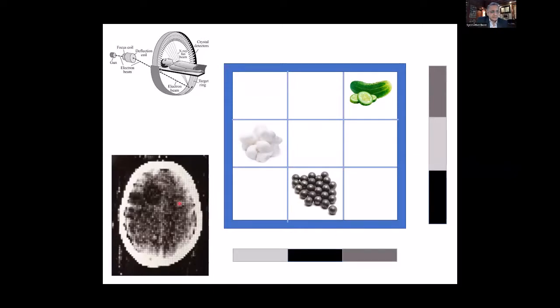And that's the same principle that is applied. Of course, the mathematical Fourier analysis that is used is much more complex. That's why they got a Nobel Prize. But it helps. And these are one of the first few images that show CT scan, and you can see those big pixels over here.